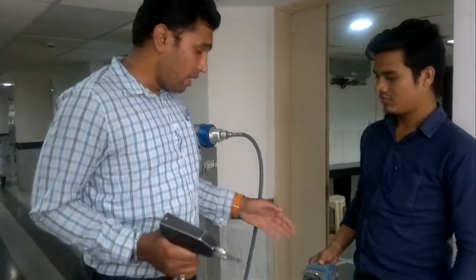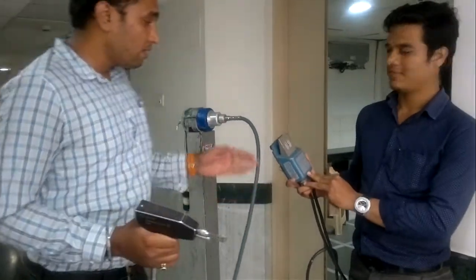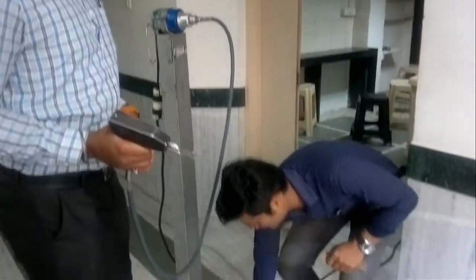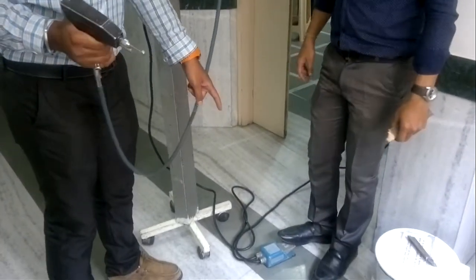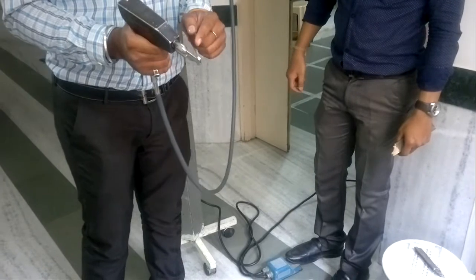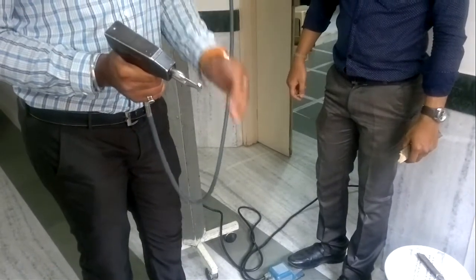So how does it operate? We have a foot controller over here. He is going to demonstrate for us. On pressing the foot switch, there is movement over here. It is a precisely controlled movement.